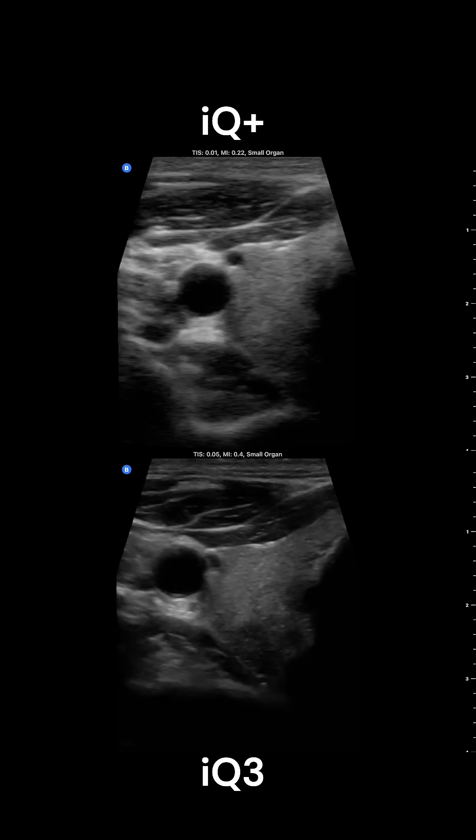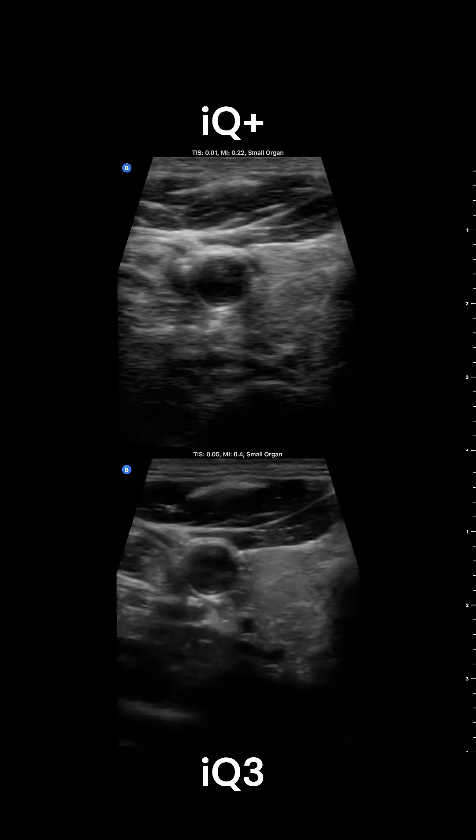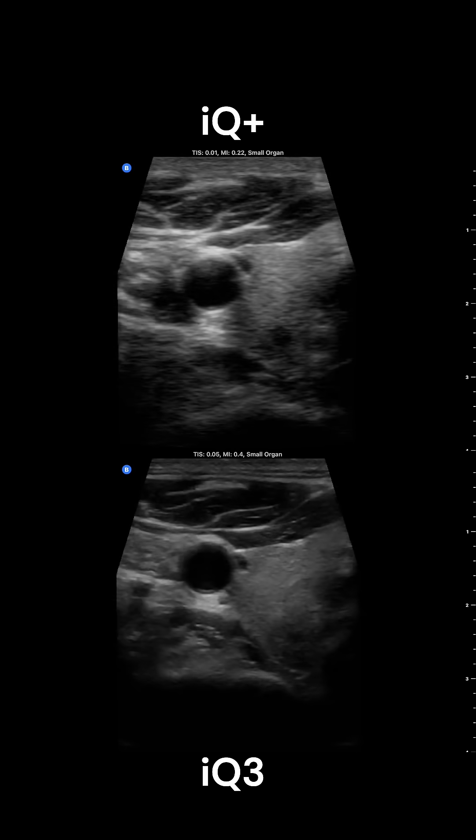And here's a thyroid gland with the adjacent carotid artery, and once again, I really like the increased crispness and clarity that I see on the IQ3 image on the bottom in small parts preset.